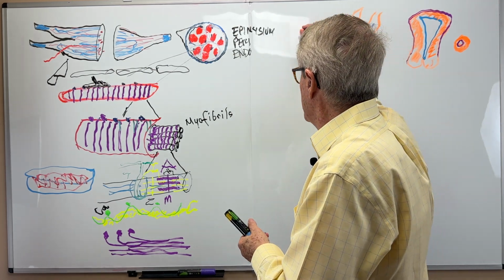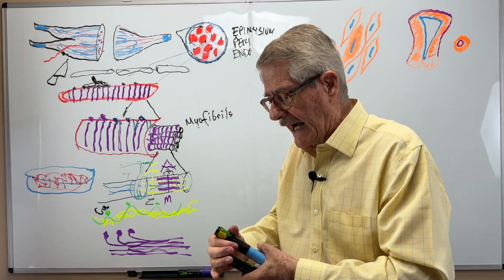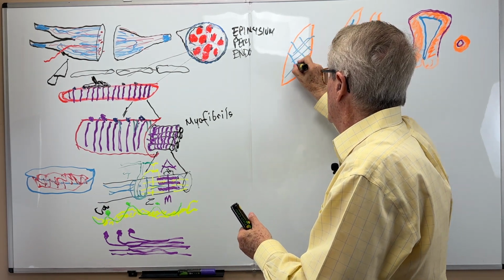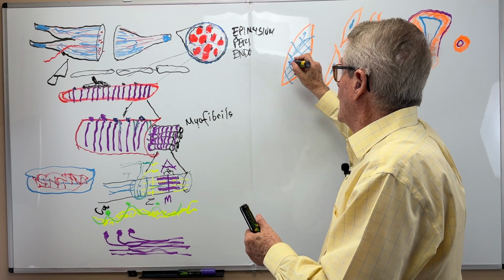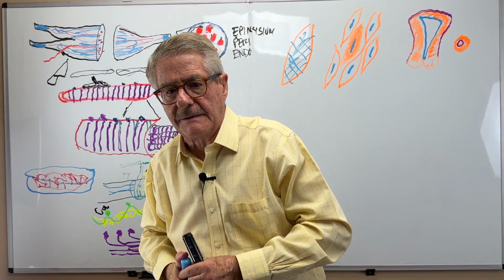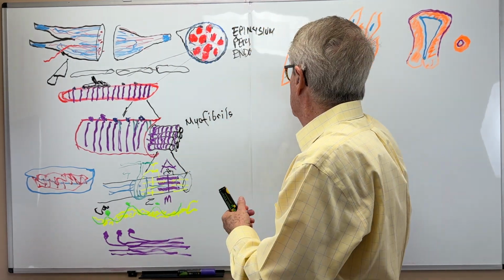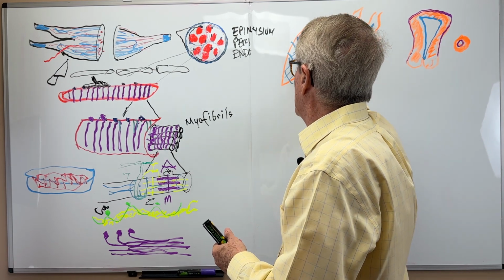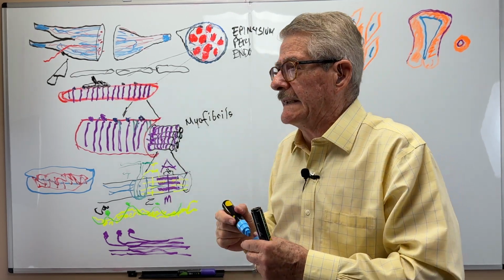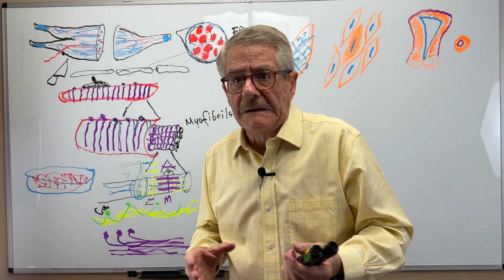Simply because the filaments of actin and myosin are crisscrossed like this. They are not forming fibers, but they are forming a crisscrossed pattern. They go from an adhesion density here to a focal density here, adhesion density, focal density, etc. And that is pretty much the way it is.